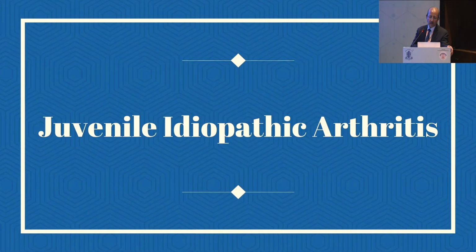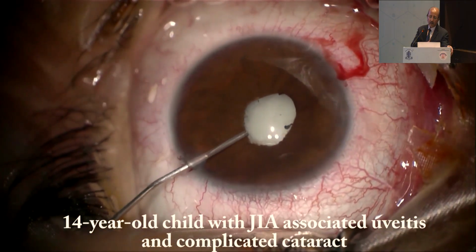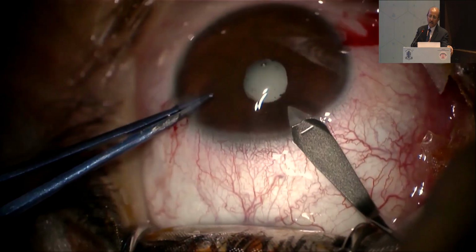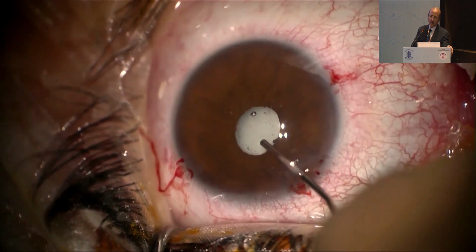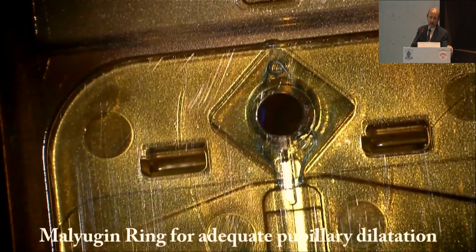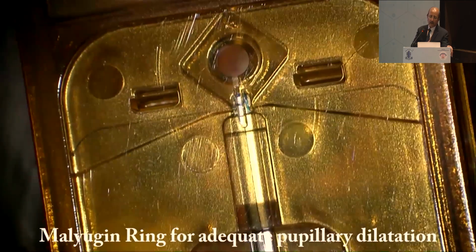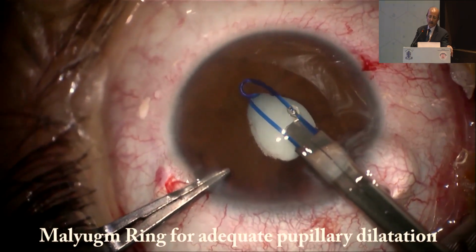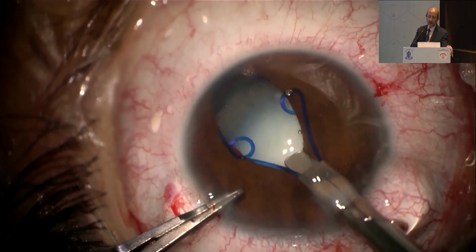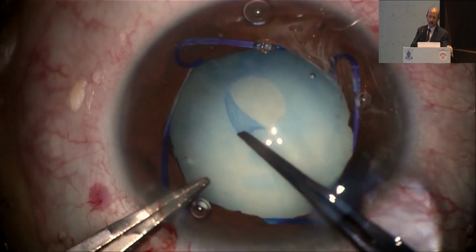And then comes another child with juvenile idiopathic arthritis, having 360-degree posterior synechiae. In such a situation, synechiotomy is done, and then place a Malyugin ring or any other device to adequately dilate the pupil. But we must know how to place this Malyugin ring. It is easy to place, not difficult.